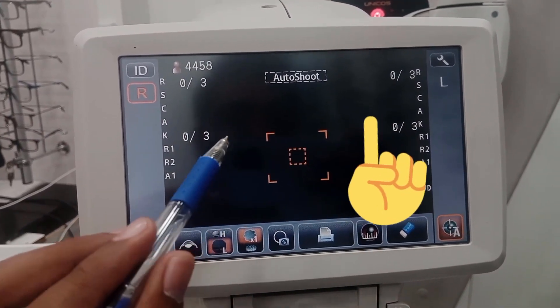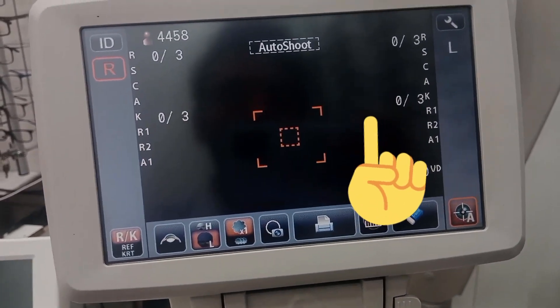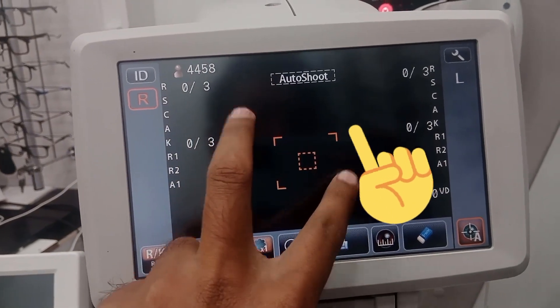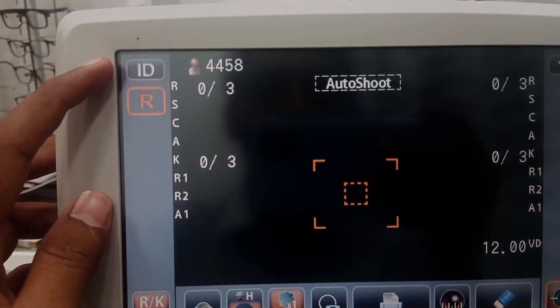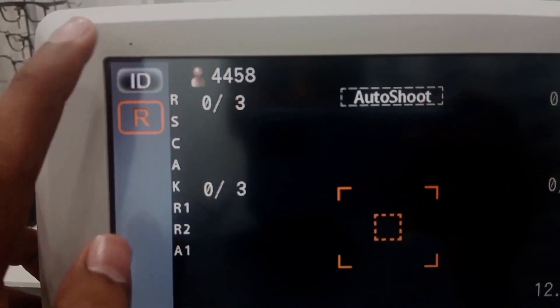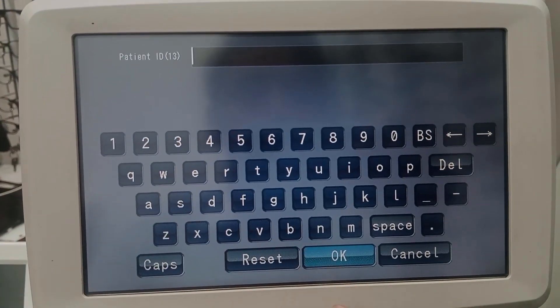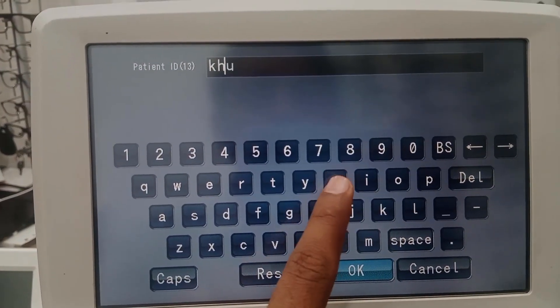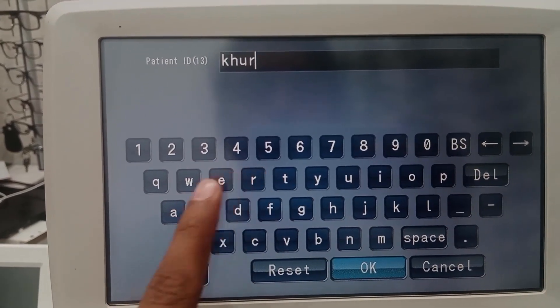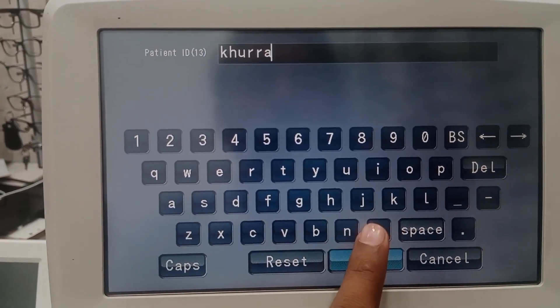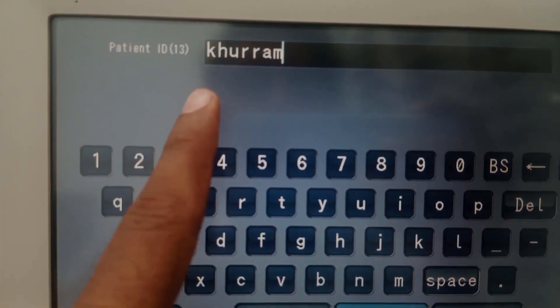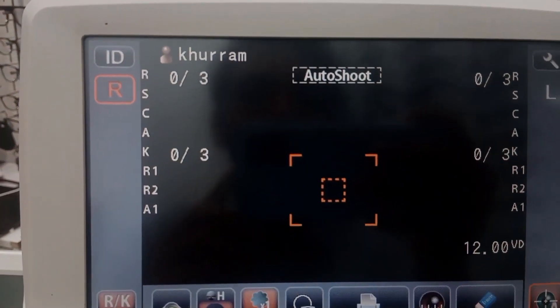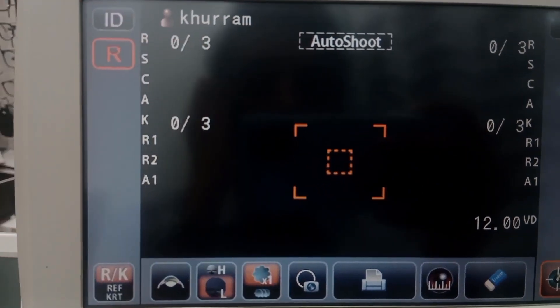Do not touch with a pointed object or two fingers simultaneously on the screen, because the screen is fully touch-sensitive. Pressing the ID button lets you enter the patient's name or ID of up to 13 digits.